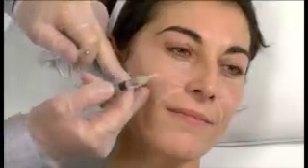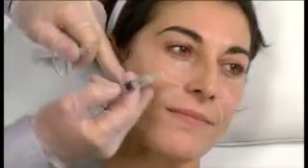Okay, she would definitely benefit from having another fan here, but I think we're a bit short on time because people are starting to move a little bit nervously here. No? I'm okay? Okay, so we can just continue the treatment like we're doing. Can I have some light? Okay, yes, thank you. She looks very good. Okay, so we've done our augmentation starting from here. And from here, I would like to give her another fan to treat this area because she needs some neocollagenesis here. She would definitely benefit from that.